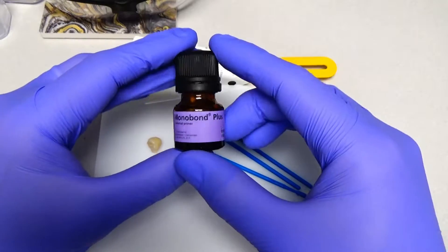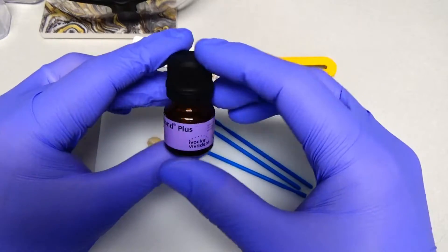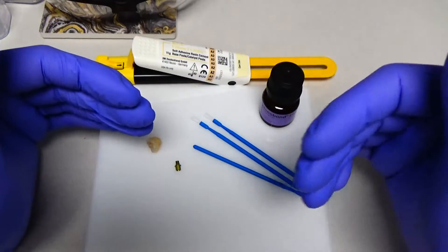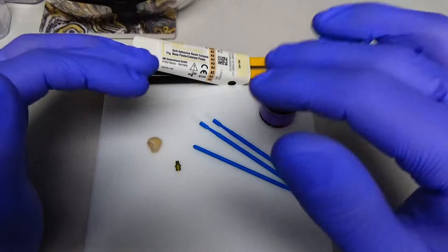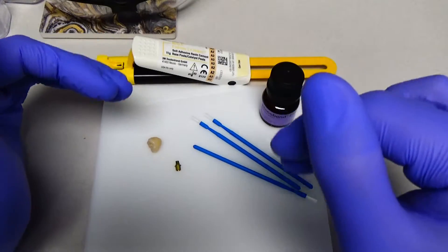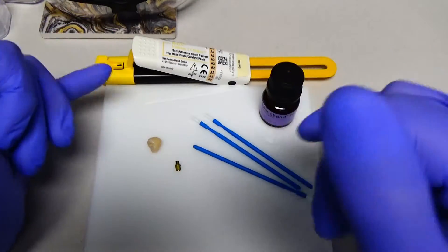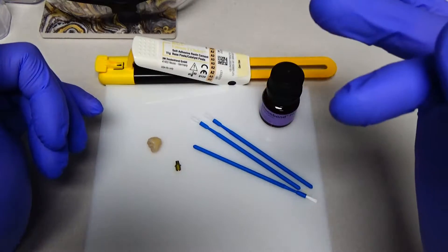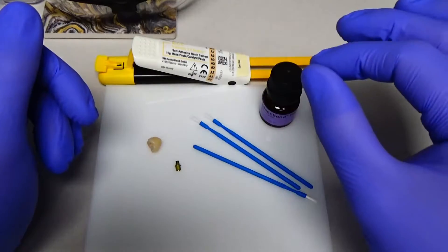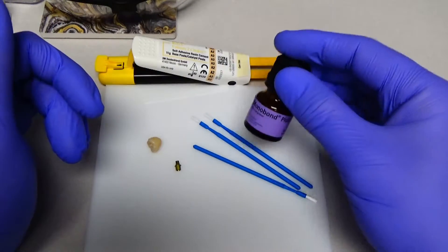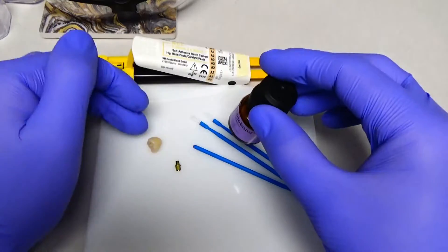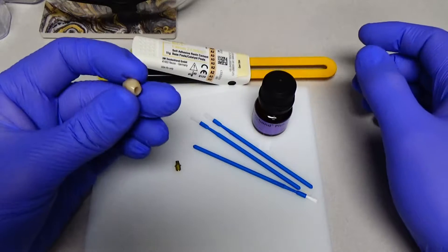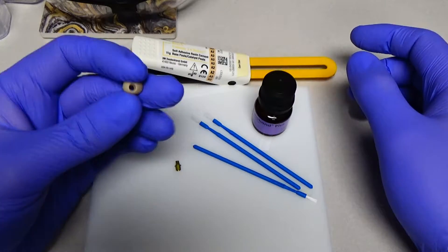And this is Monobond Plus. This is a really good product from Ivoclar. And Monobond Plus basically has everything that you need in it. It has the MDP particles, all sorts of different resin priming agents. So you can use this on composite, zirconia, lithium disilicate, metal, you can use it on everything. And that's the first thing to do is to use it on both of these substrates here in order to prime them for bonding. I've already airbrated the internal portion of the crown here.